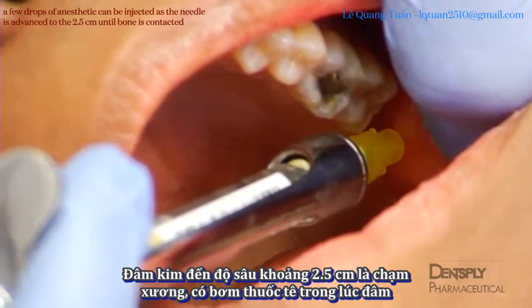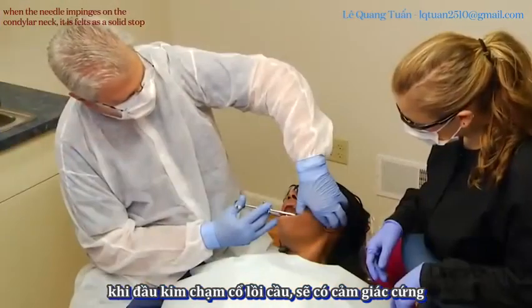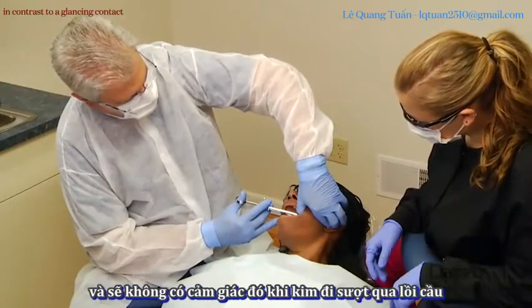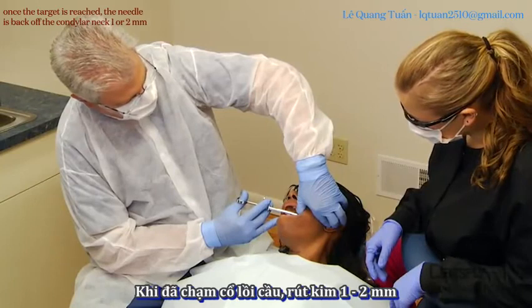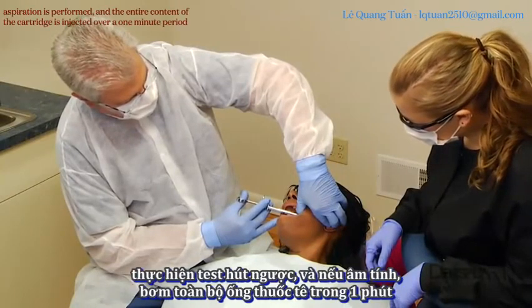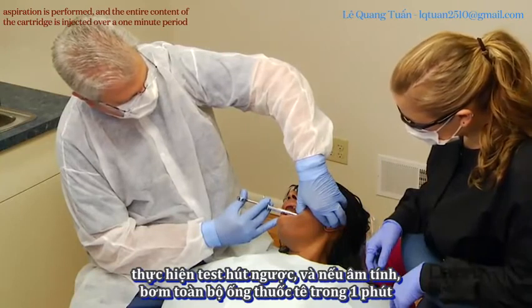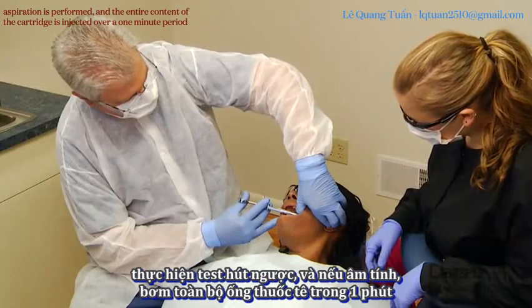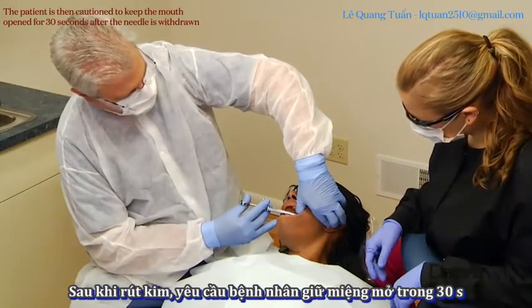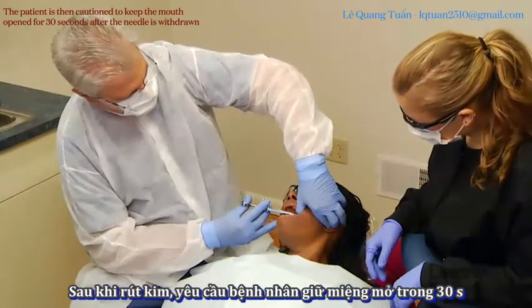is contacted. When the needle impinges on the condylar neck, it is felt as a solid stop, in contrast to a glancing contact. Once the target is reached, the needle is backed off the condylar neck 1 or 2 millimeters, aspiration is performed, and the entire content of the cartridge is injected over a 1-minute period. The patient is then cautioned to keep the mouth open for 30 seconds after the needle is withdrawn.